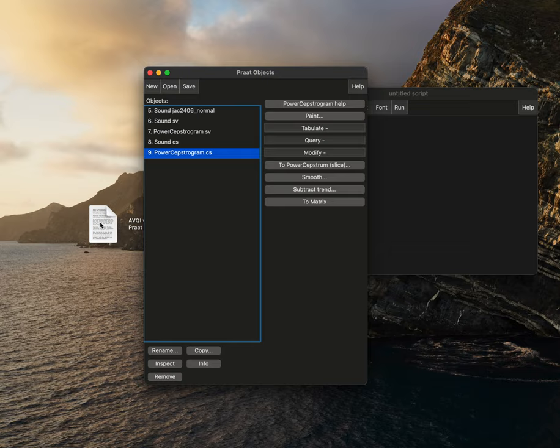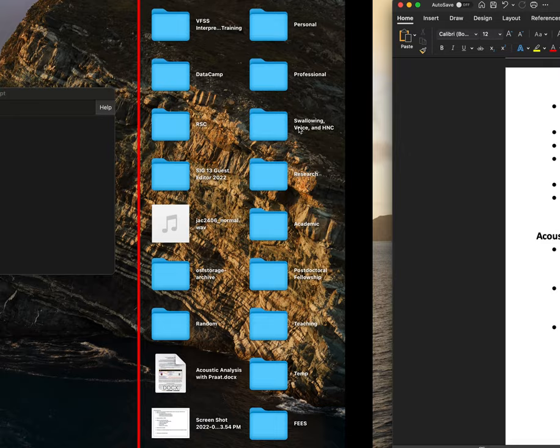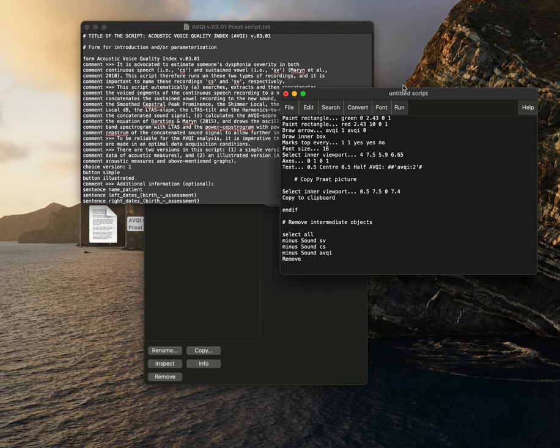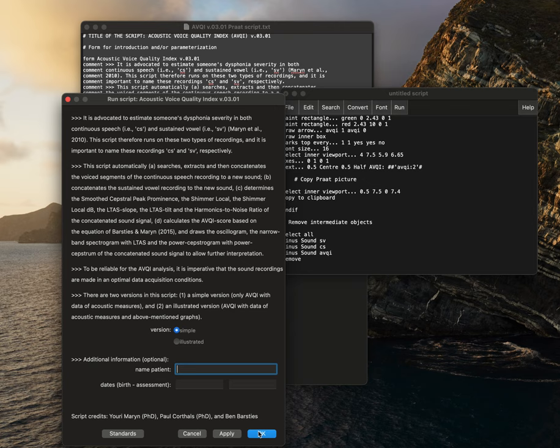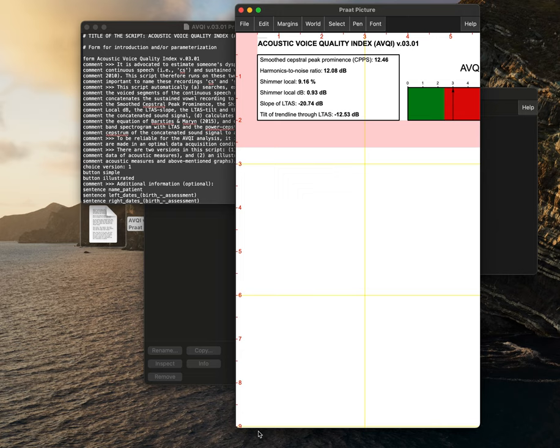We have this window here. We'll have previously downloaded the Praat Script from online. We'll then copy and paste the entire script into our script window here. We'll select Run, Run, and OK. And so this script is using SV and CS specifically, which is why it needs to be renamed those files specifically.